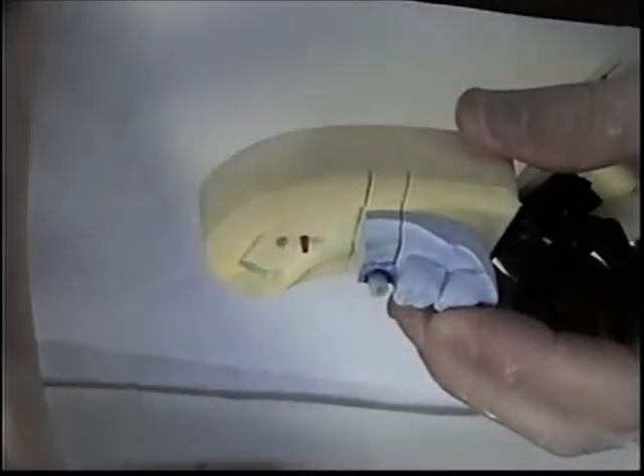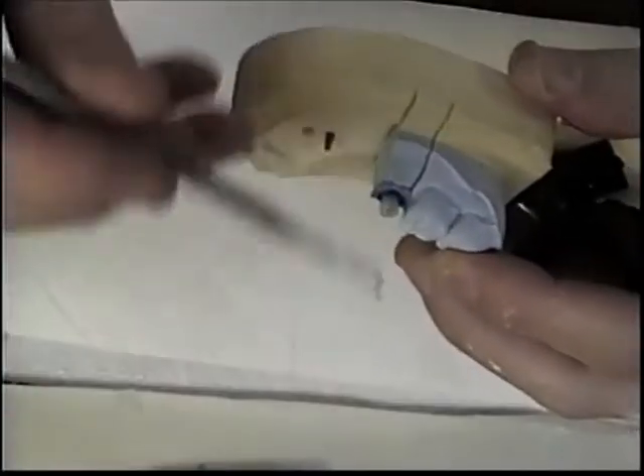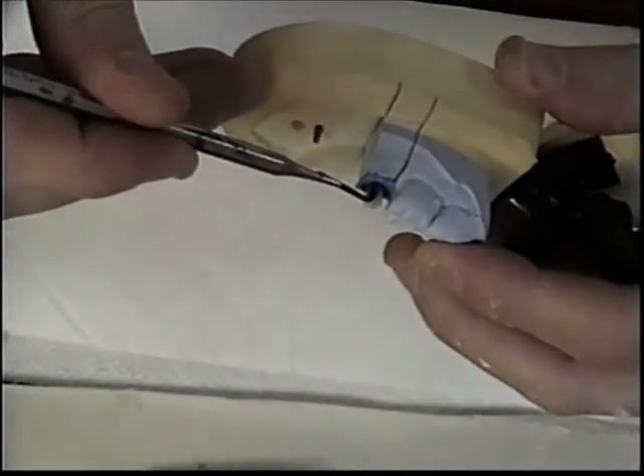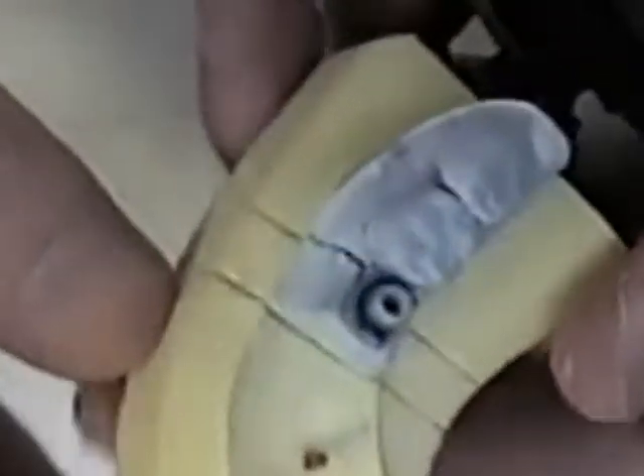Now I can also put some wax over the cylinder here — just flow a light layer. Plastic will sometimes cause your investment to crack when it's burning out, so I'm going to coat this with some wax. And it's also a good time to build up any areas that you need to.